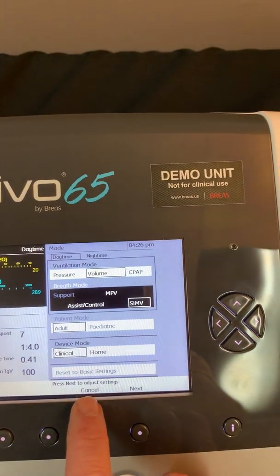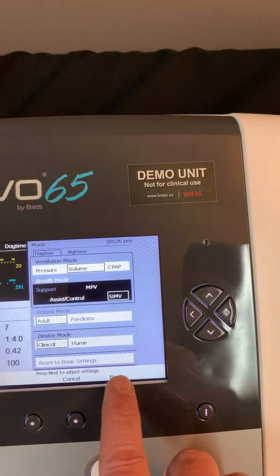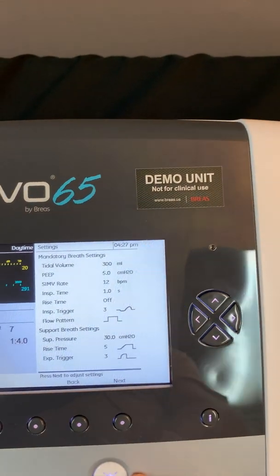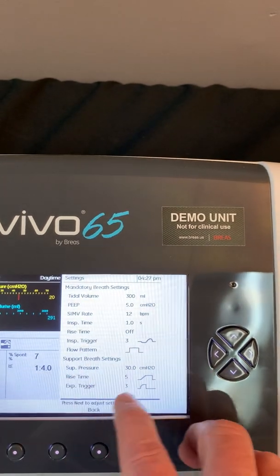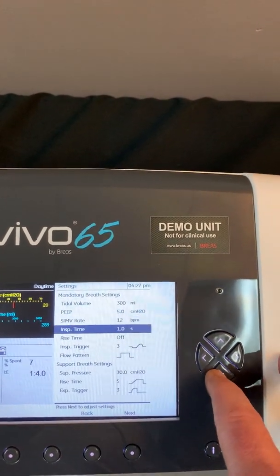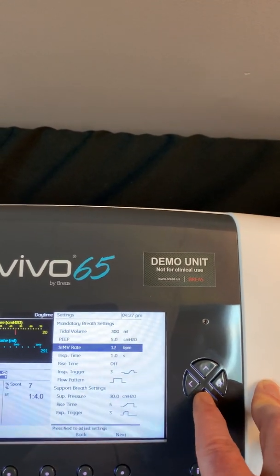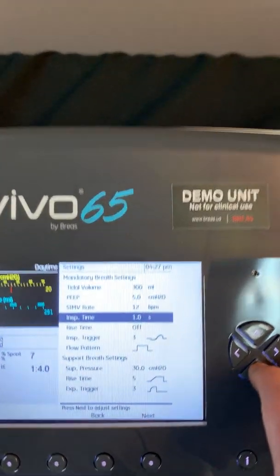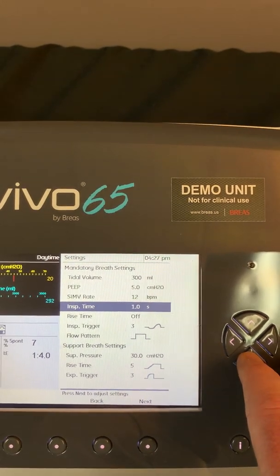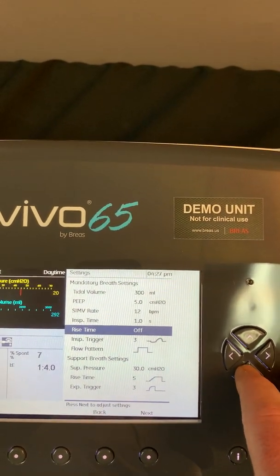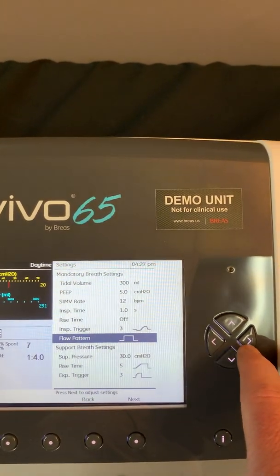Down here you'll see a cancel button to cancel out of making a mode change, or a next option. I'm going to press the next button, which is now taking me to my settings. All of my settings are on one screen. Navigation through this menu is exactly the same as the mode menu — up and down to highlight, left and right to change. I currently have a tidal volume of 300, a PEEP of 5, a set SIMV rate of 12, inspiratory time of 1, rise time is turned off currently, inspiratory trigger of 3, and a flow pattern of a square waveform.